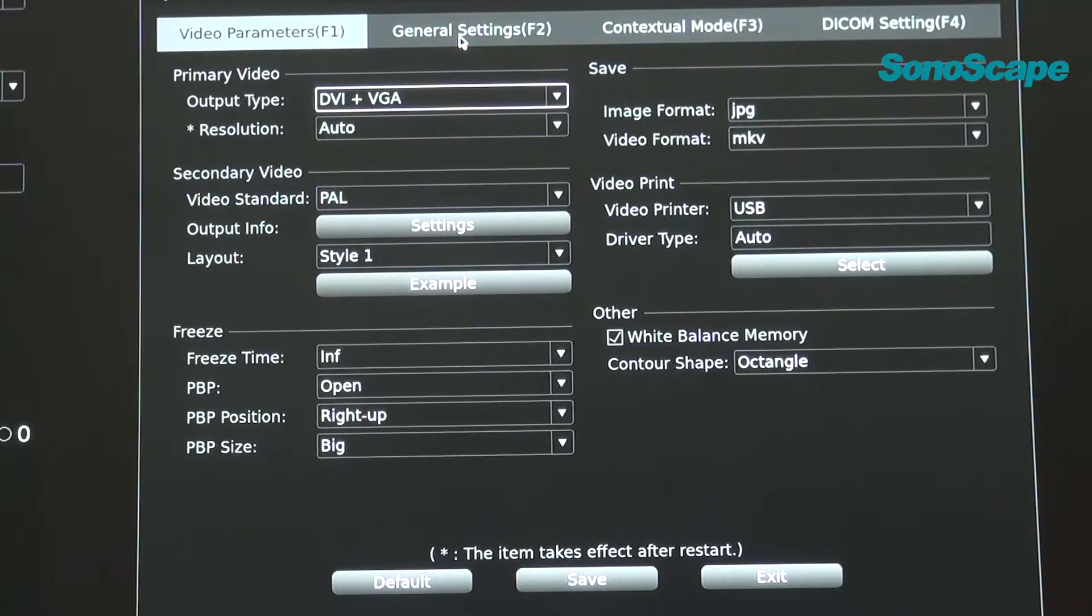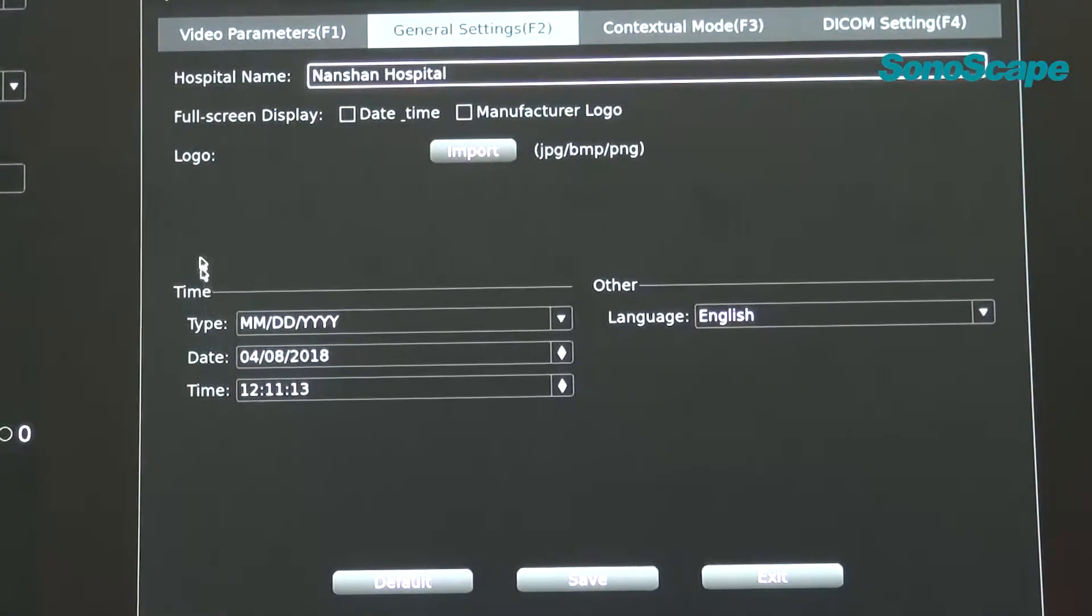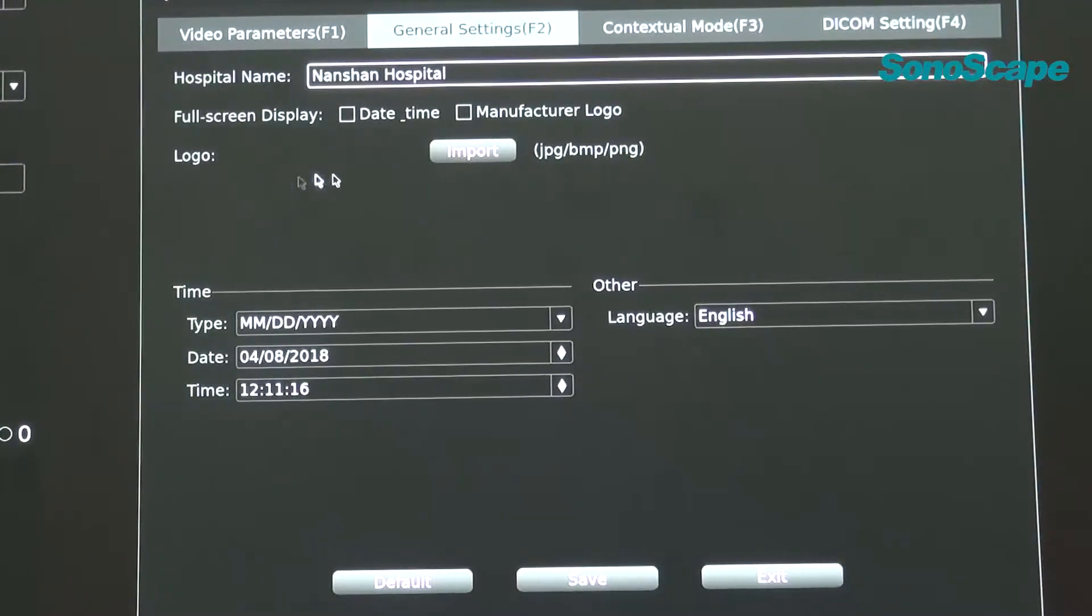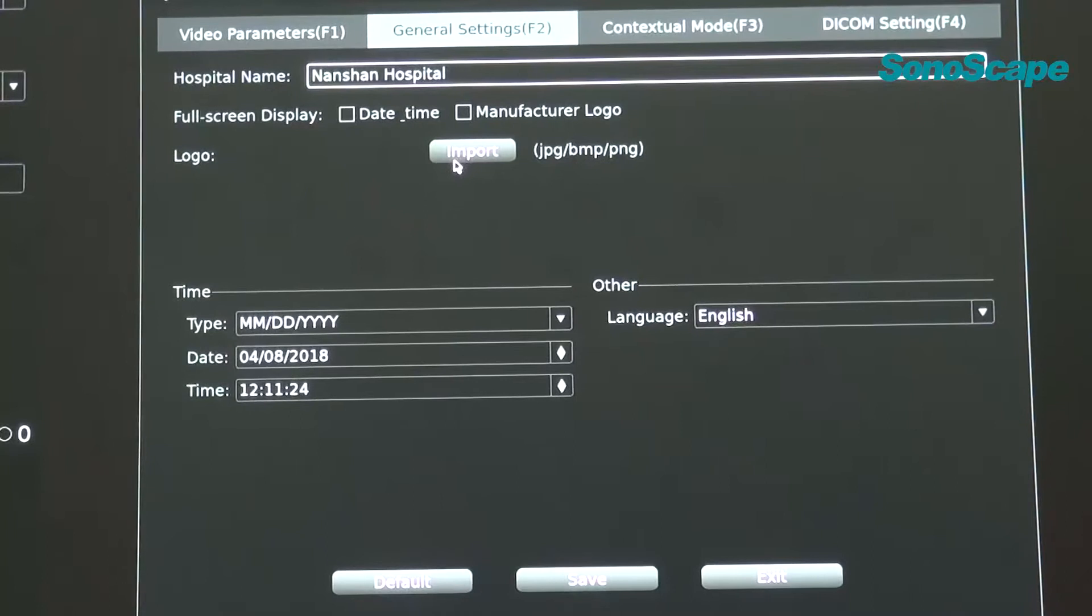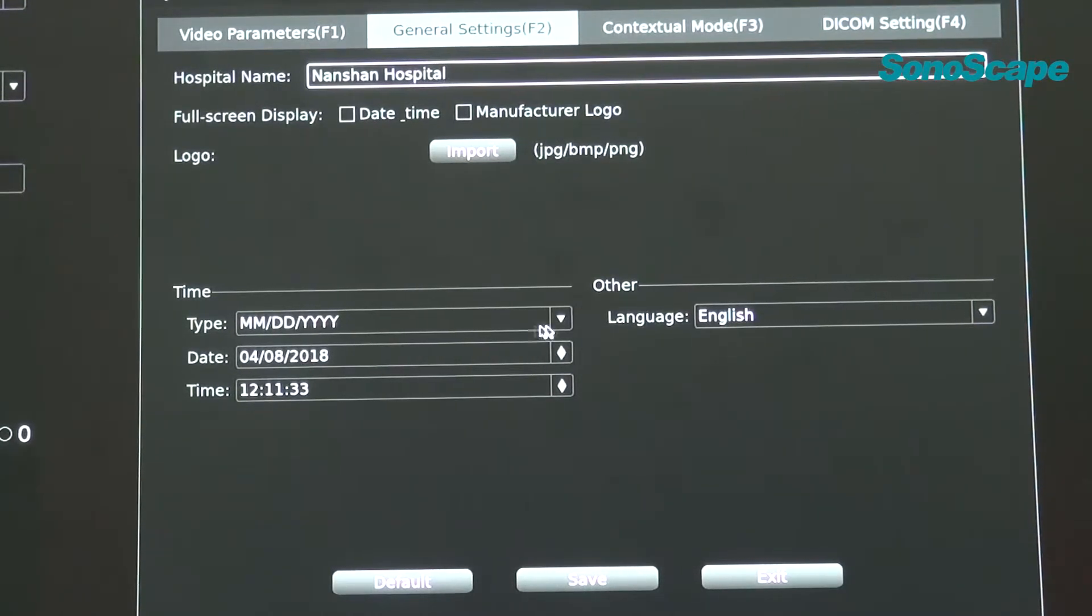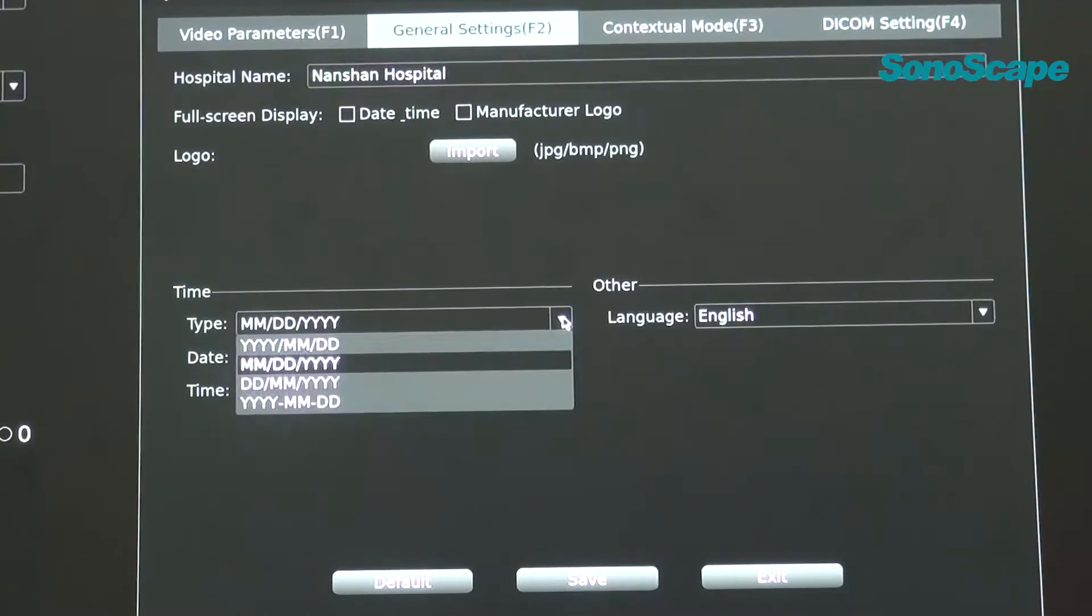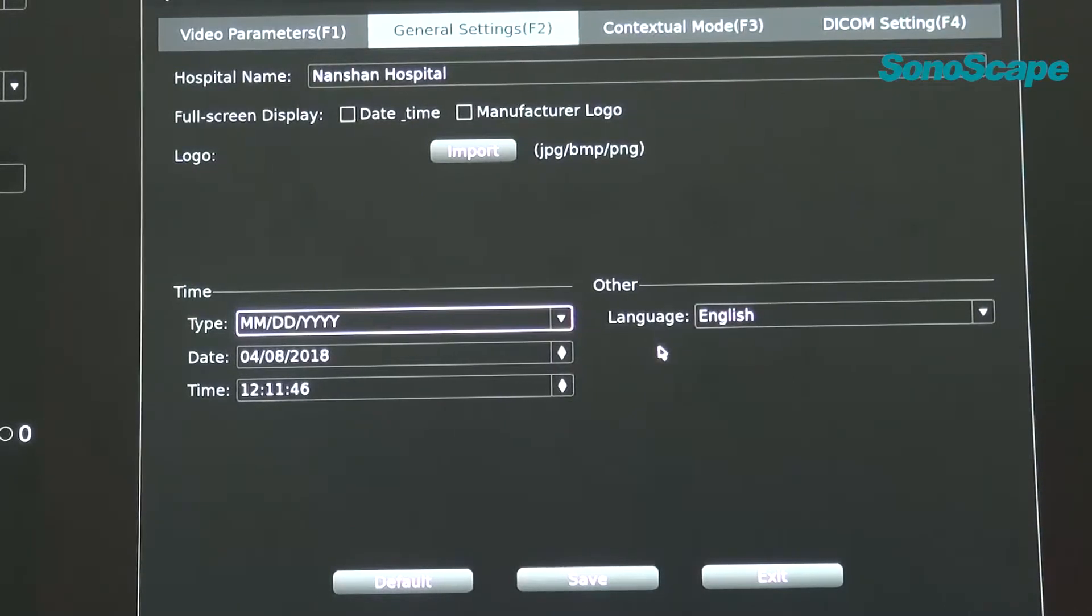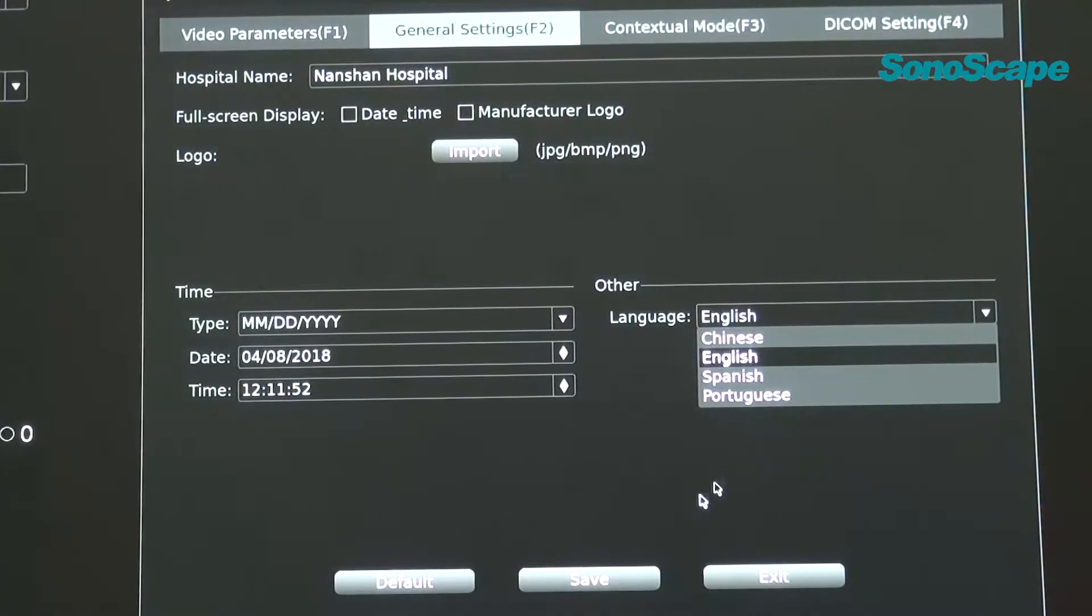And then, we will come to F2, general setting. In this interface, you can type the hospital name. And also, you can import the logo of the hospital. But do remember that, the format of the picture you're going to input is JPG, BMP, or PNG. And also, for the time, you can do settings here. You can click the narrow arrow up and down to change the date. And also, you can select the type of the time. And here is for the different selection of language. You can select English, Spanish, Portuguese, and Chinese.